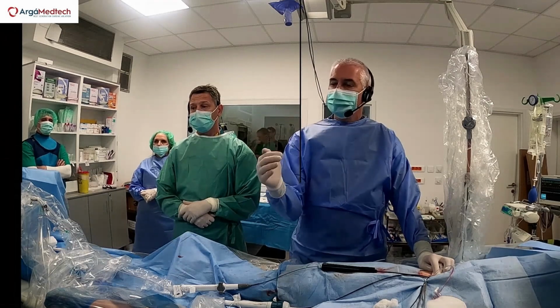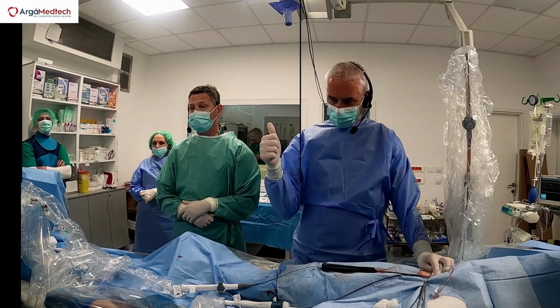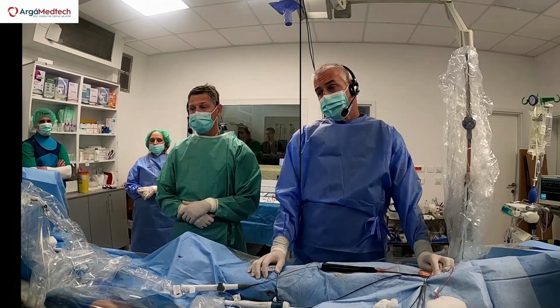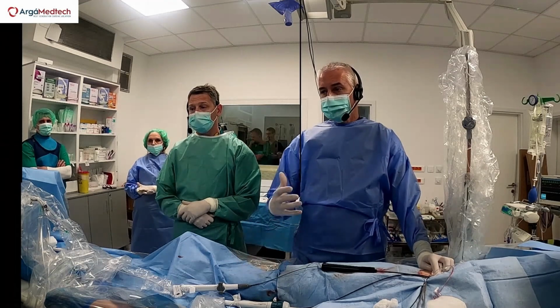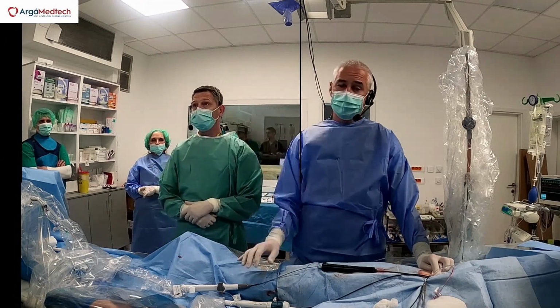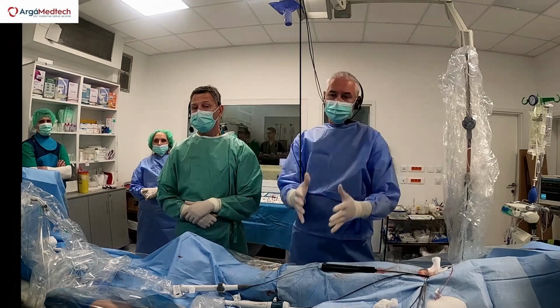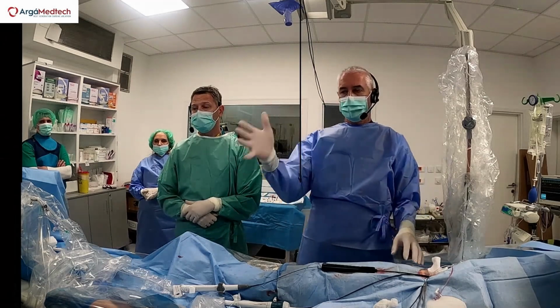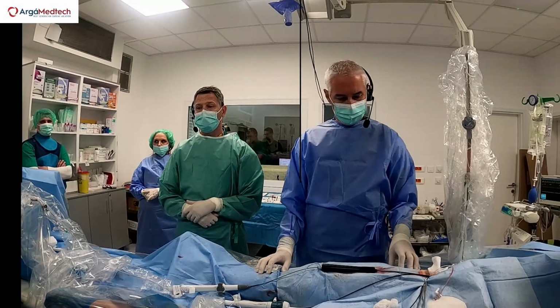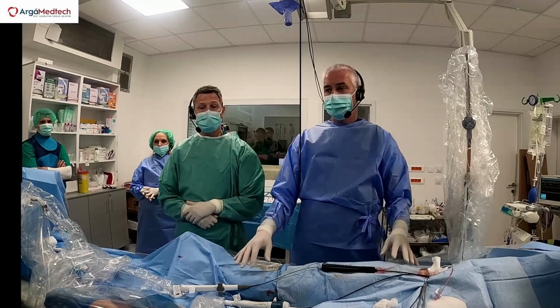In a CTI, we again use max because, with CTI, you care about the tissue. Sometimes it's very complex. The architecture can be thick. And of course, the contact is not always super stable. I was satisfied with our contact here. I might leave things like this, but I will apply several more focal applications to reinforce this in a CTI. So no, we are not applying the same dose. We are adjusting the dose based on what we are ablating.